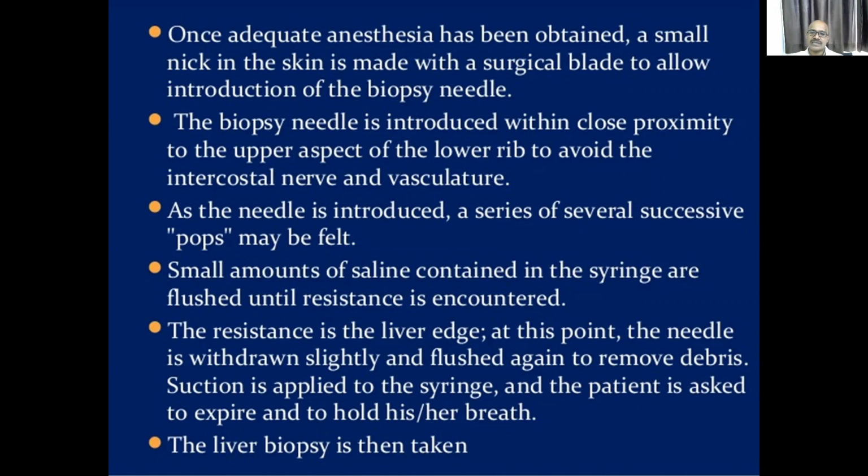Suction is applied by the syringe and the patient is asked to expire and hold his breath. The liver biopsy is then taken. So during biopsy, the patient is asked to hold his breath in expiration.